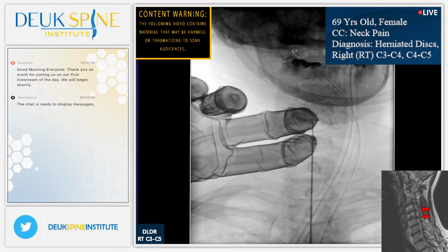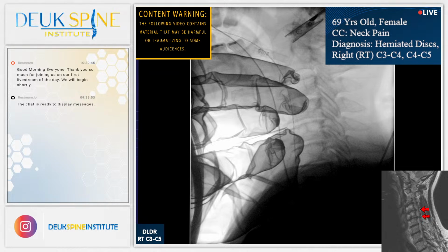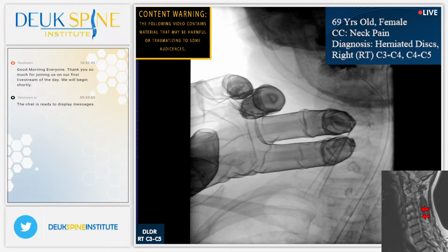So the first step is getting into the spine, and her neck is very supple, very, very nice. There's a little bone spur there, shot. Now let's see where that is. That should be in the middle. Quick AP. Shot. All right, that looks better. We're still off on rotation. Derotate it, please. All right. That looks good. Give me a lateral, please.